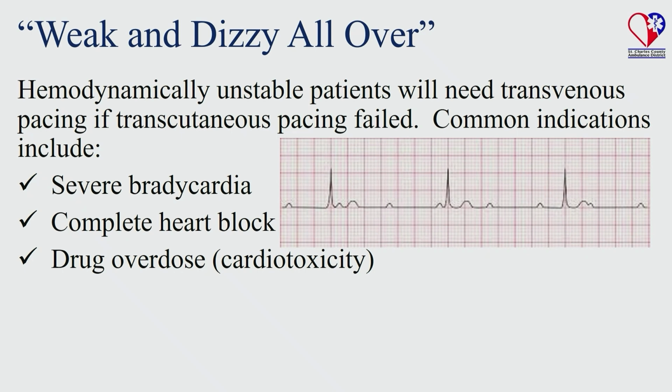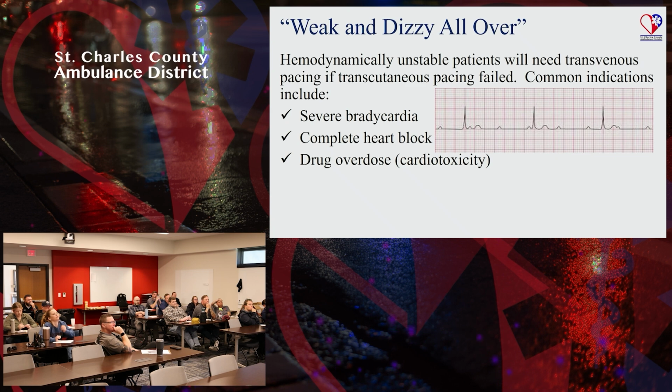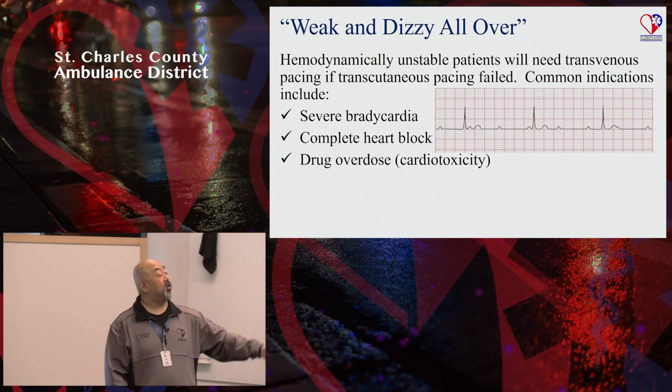You sure it's not Wenckebach? You should have enough information there. There's a P wave between the QRS and the T wave, so that one would be Wenckebach. Right. You're right, it's third degree. So the P waves are all going out, but they're not at all in relation to the QRS complexes. So yeah, you're looking at third degree block.